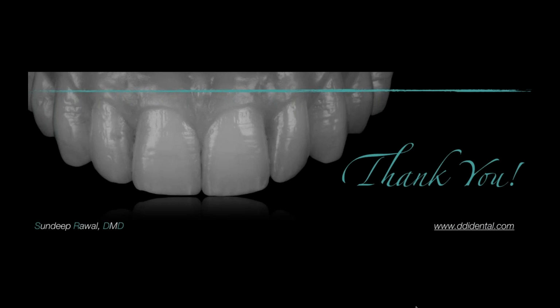But if you're just starting out, if I were building a practice from scratch and capital investments and expenditures were something I was sensitive about, I would certainly buy an intraoral scanner first, get that fully integrated into my practice, because you can always outsource your CBCTs. There's plenty of imaging centers in communities today. And then once I'm doing a lot of CBCT outsourcing, when I know I'm spending on 3 to 5 to 10 patients a month, I would bring that CBCT piece in-house. And by the time you do that, you'll realize you're using CBCT on every single patient, like we do.